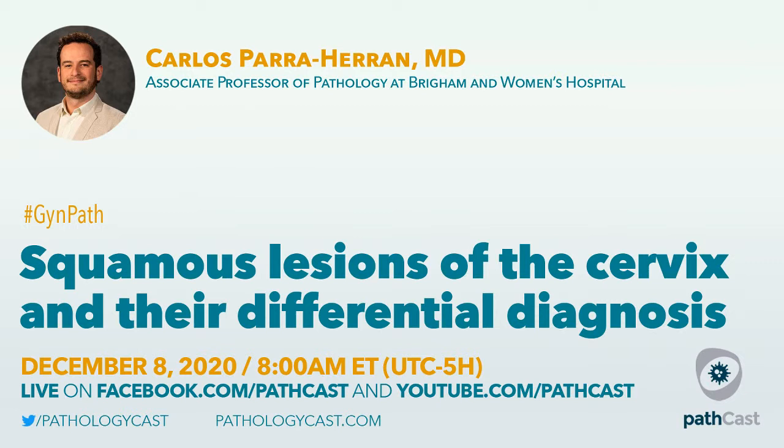Okay, I'm going to read some of the questions that were posted in the chat. Is P16 helpful in distinguishing between cautery artifact and HSIL? I've done it in the past, but keep in mind that the cautery artifact can also hinder your interpretation of the stain. In other words, it may be very difficult to interpret the staining for P16 in the area of cautery.